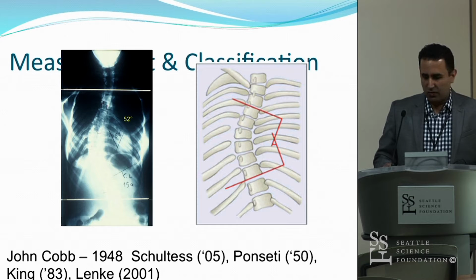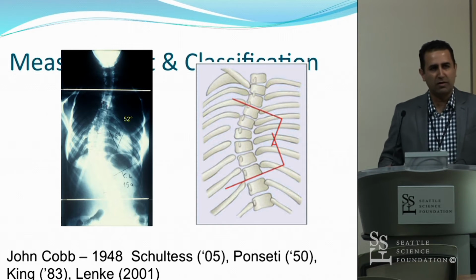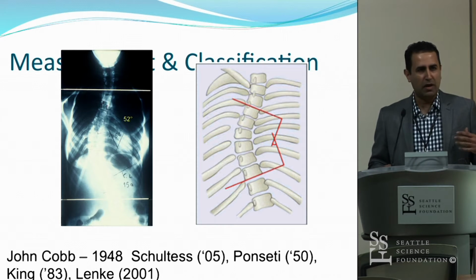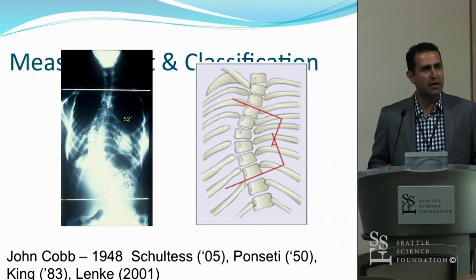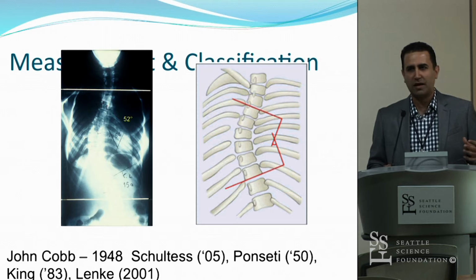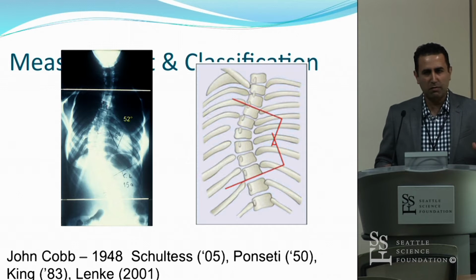So we're so familiar now with our spinopelvic angles and parameters, and it's become a staple of understanding what we need to correct when it comes to the spine. But as much as it's been a dawning for many of us clinical surgeons, surgeons have looked at this for many, many years.